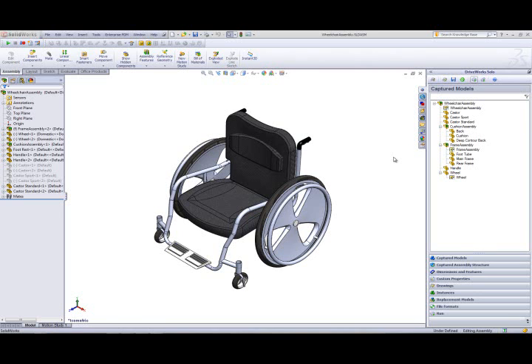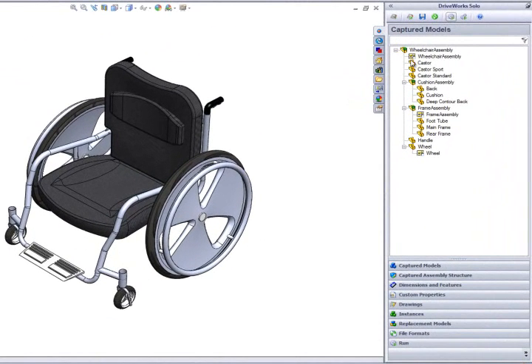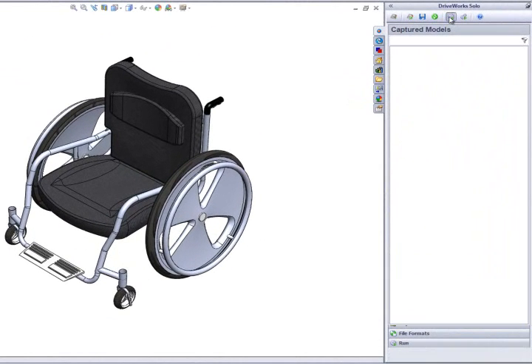This example project, along with several others, is available to download from the DriveWorks Solo website. Once we have downloaded and installed the project, we can run a new specification by clicking the button at the top of the DriveWorks Solo task pane.